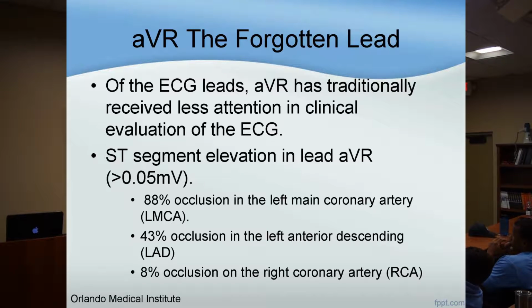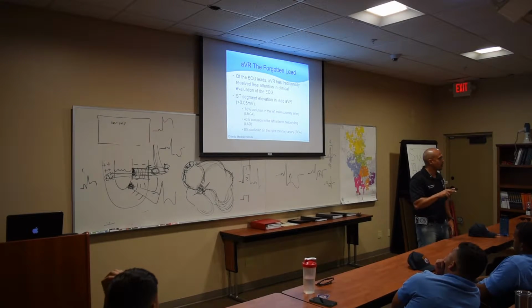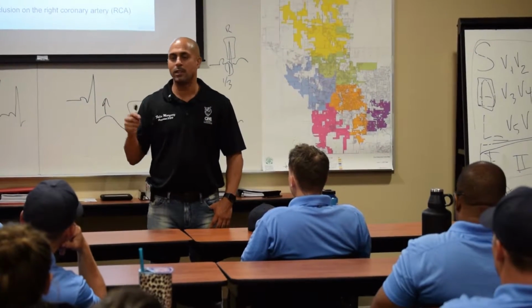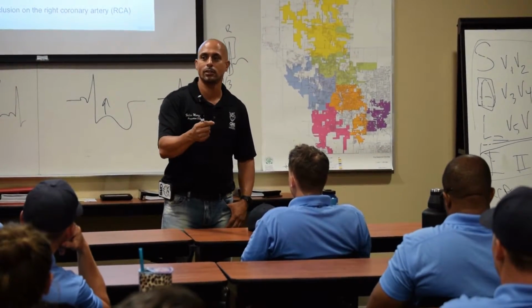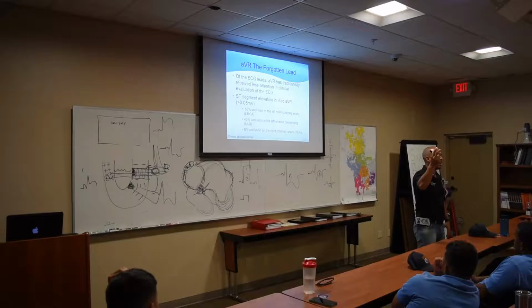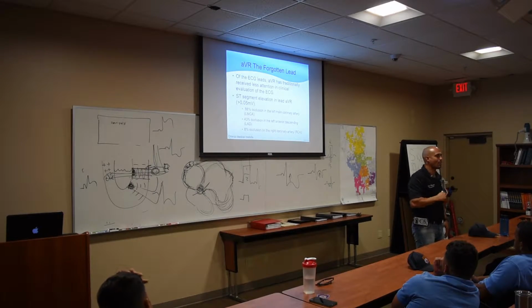Something new. This is something you're going to hear. You talk to a lot of medics, they haven't heard this, but this is new discovery and evidence, probably in the last year or so. AVR. It's so funny. We call it 12 lead, but we don't use AVR. Why don't we call it 11 lead? You know why we don't use AVR? Because we always taught you, you have to have 2 or more contiguous leads. Who's contiguous to AVR? Nobody. That's why we never used it.